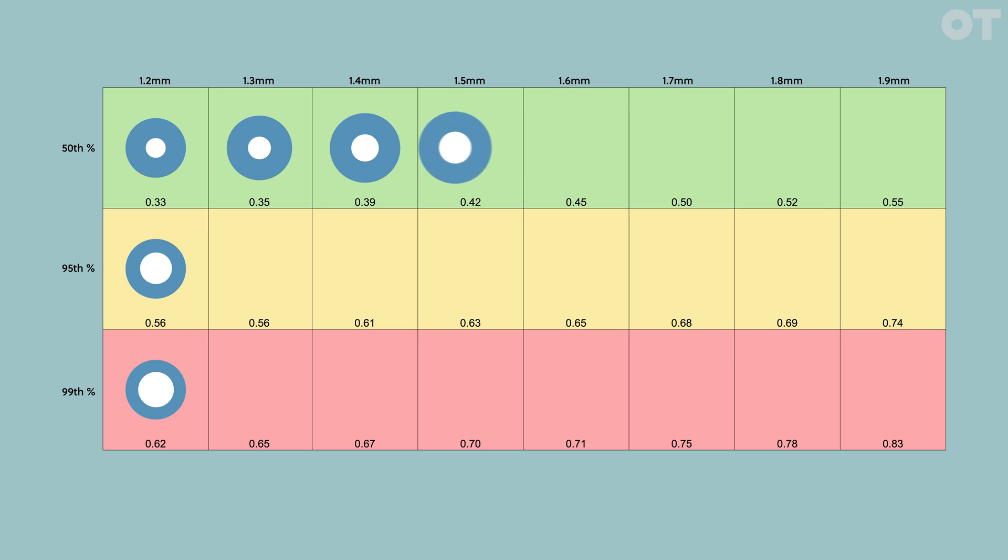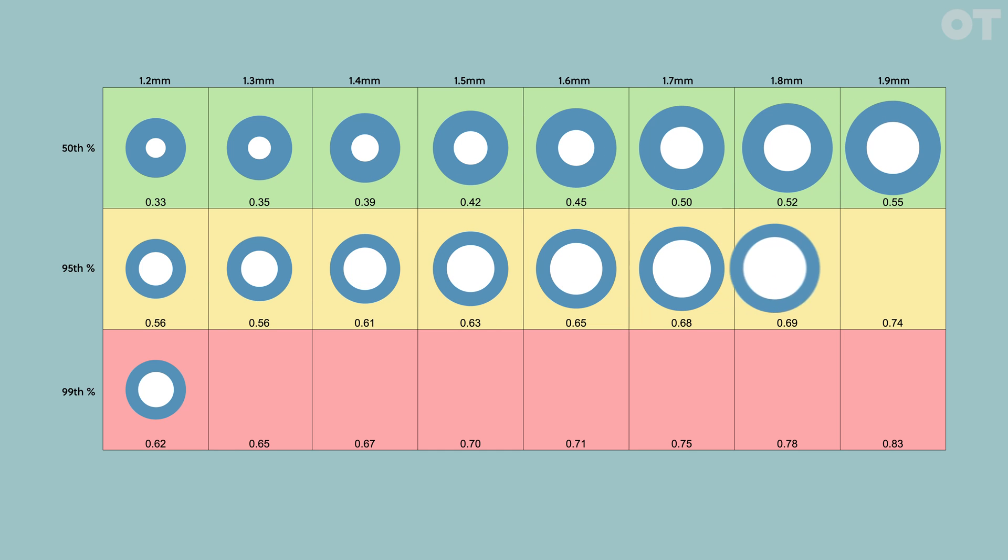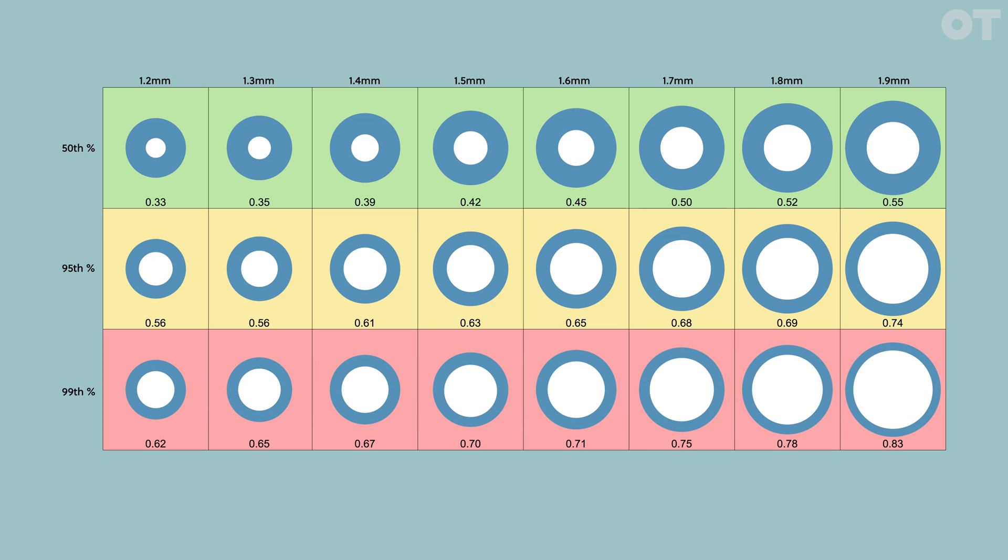You can see it uses a traffic light system. It shows you the spread of CD ratios found in various optic nerve sizes in non-glaucomatous eyes. The CD ratios in the red zone are the 99th percentile. Only 1% of non-glaucomatous eyes have a CD ratio of this size.